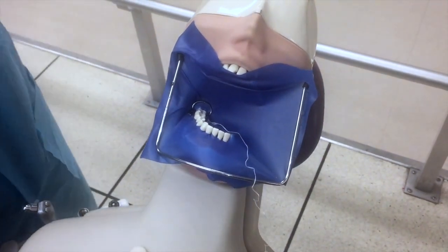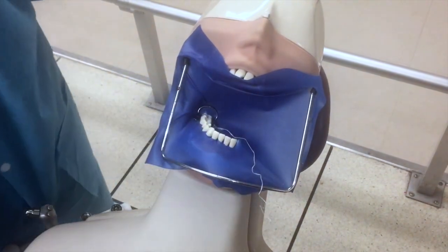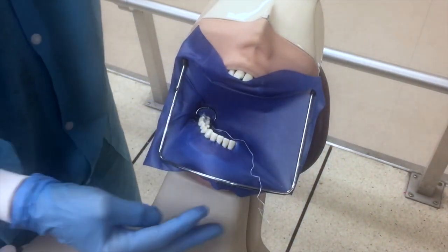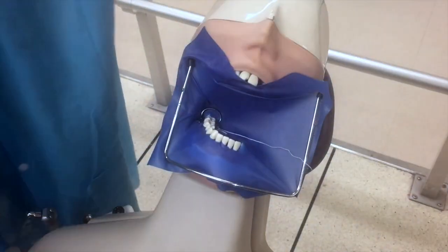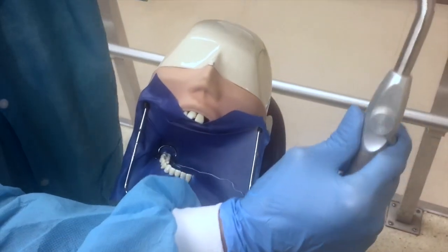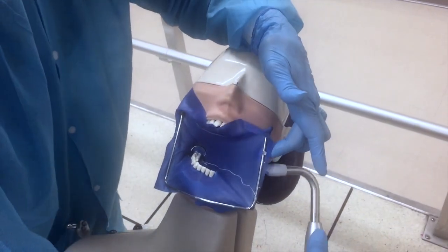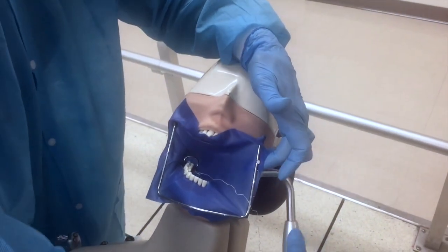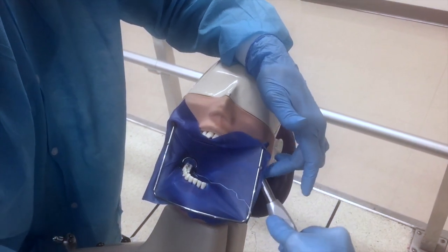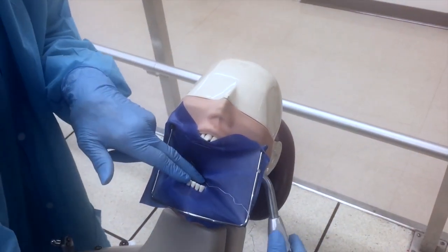Your next question is, can the patient swallow like this? Yeah, they can swallow. Or if they can't, maybe you have to go under. Let's pretend that this is one of the plastic saliva ejectors. This is the high volume evacuator. You just put it under there. You can bend the plastic ones and leave it there if necessary.